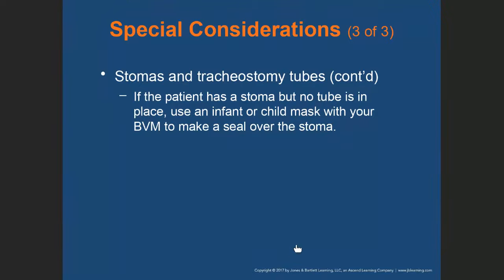Sorry about that. If the patient has a stoma but no tube is in place, use an infant or child mask with your BVM to make a seal over the stoma.